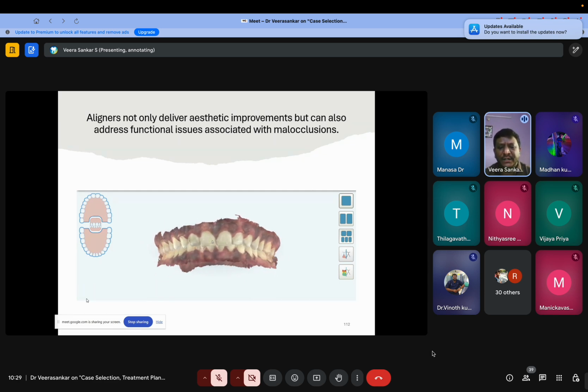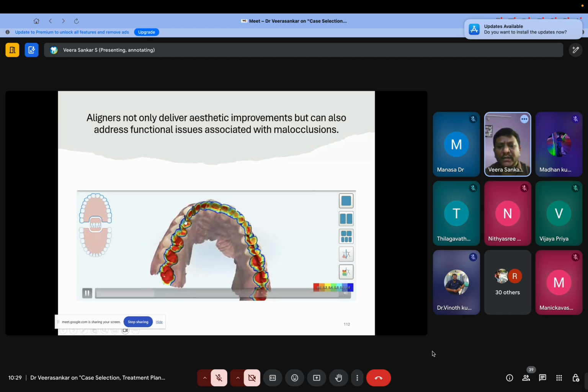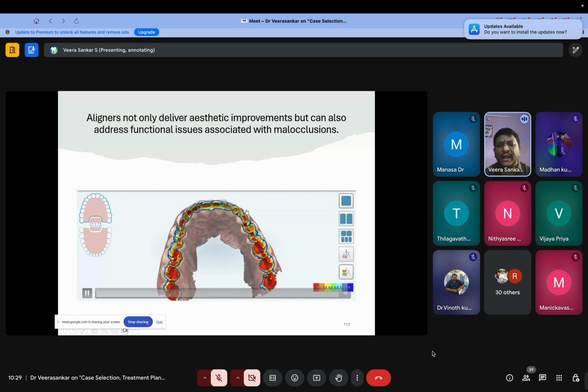This is a case of a patient who comes with an anterior traumatic bite. Whenever the patient opens and closes, there is a traumatic occlusal interference on the anteriors. There is trauma of the anteriors. This particular option in an intraoral scan helps us to visualize and show the patient how the lower anterior teeth are traumatizing the upper anterior teeth, and the need for its correction.